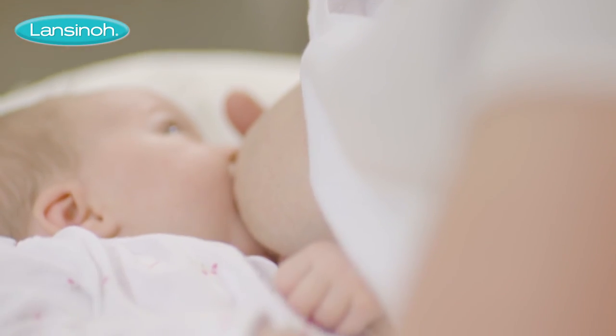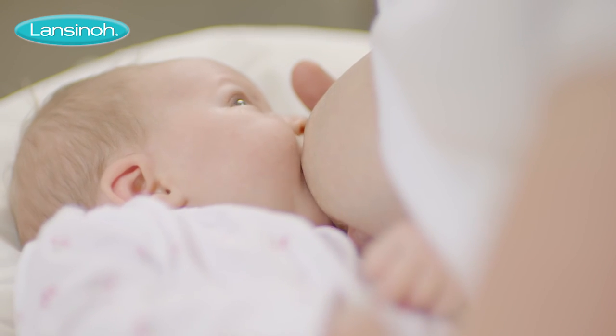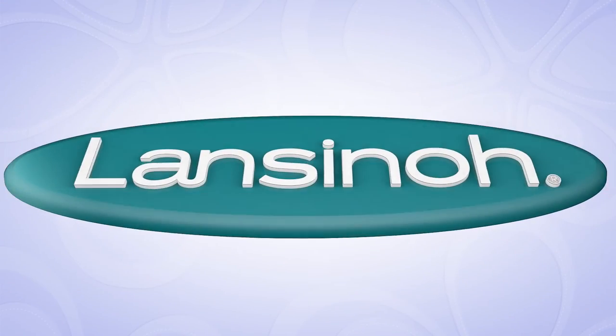Therapearl 3-in-1 hot or cold breast therapy from Lansinoh — helping mums breastfeed longer.